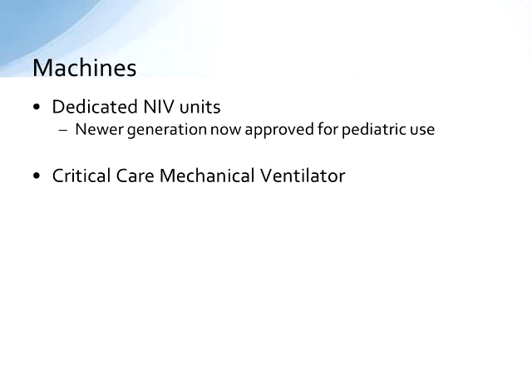One of the bonuses to using a dedicated non-invasive unit is they tend to be better at compensating for leaks, though some of our newer generation mechanical ventilators are getting better, or some of them are pretty doggone good at it. They tend to have more features that are aimed at enhancing patient compliance and comfort, like leak compensation, some better adjustments with triggering or cycling mechanisms, rise time, e-sensitivity, stuff like that.